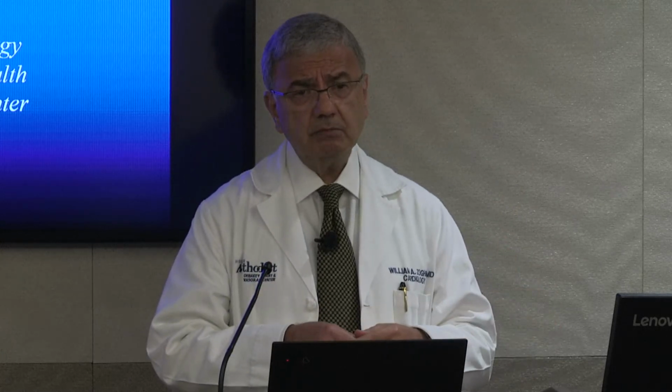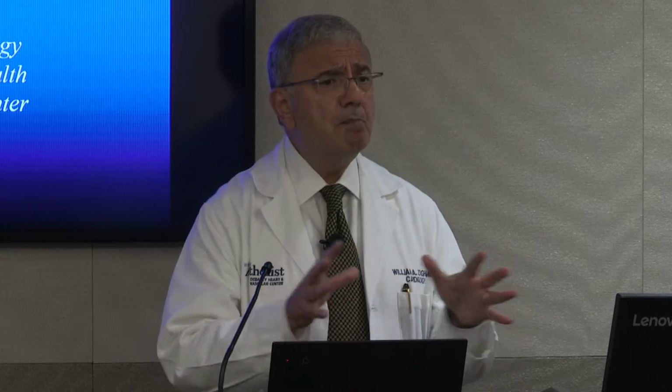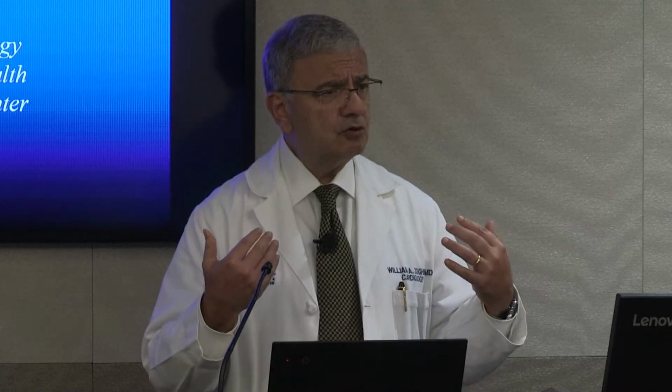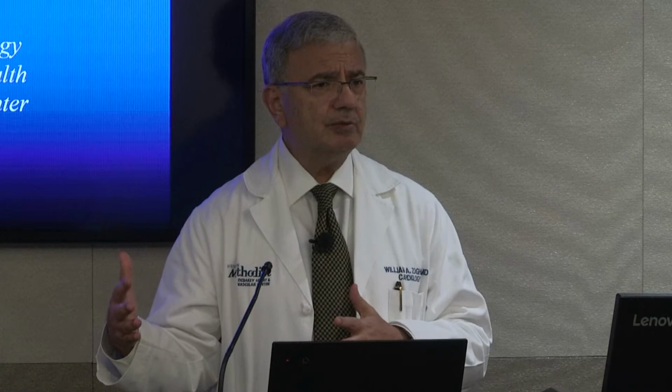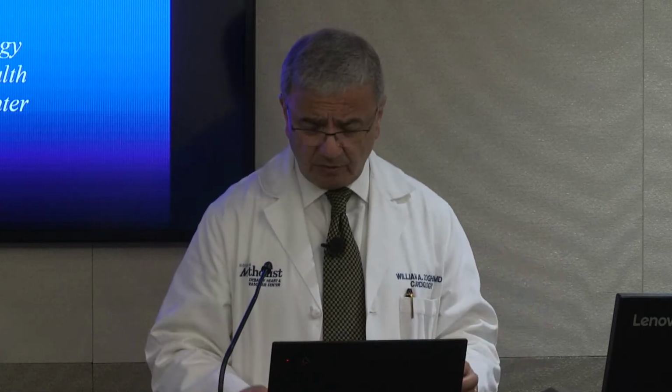2 is, interestingly, I send these waves, and if there is some motion, blood and tissue, the reflected waves are changed, there's a frequency shift, and that's where the Doppler equation comes on board. So these are the 2 major principles. Okay, so that's what we're going to go through today.